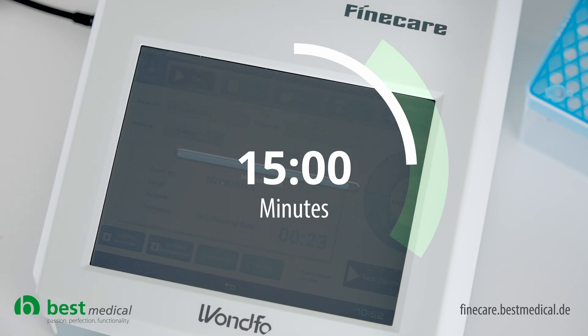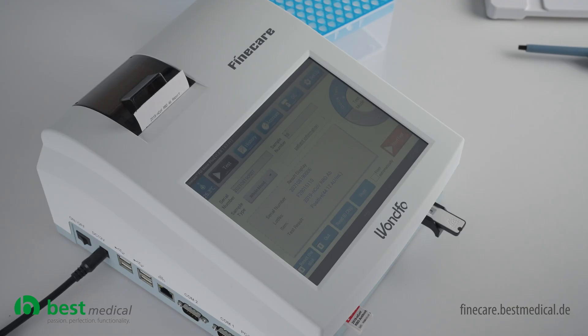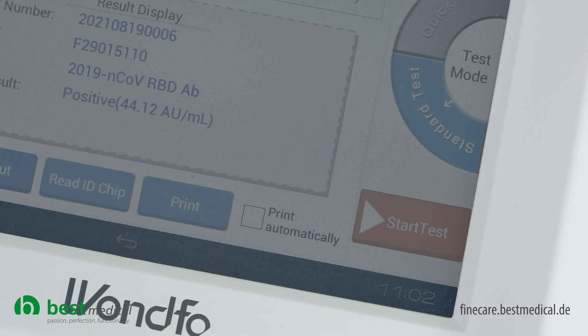This takes approximately 15 minutes. After the test has been completed, you can print out the result — in this case positive — directly. It is also possible to set an automatic printout directly after the test.